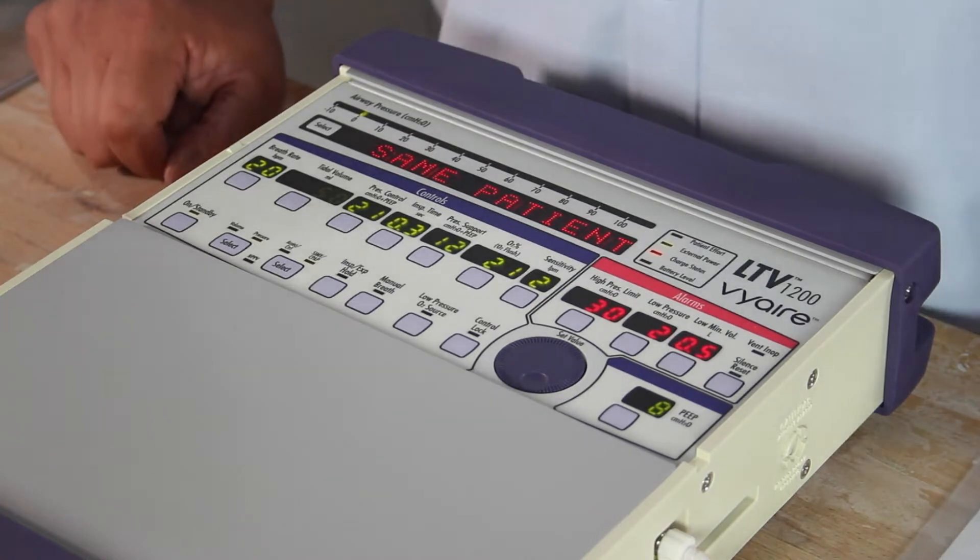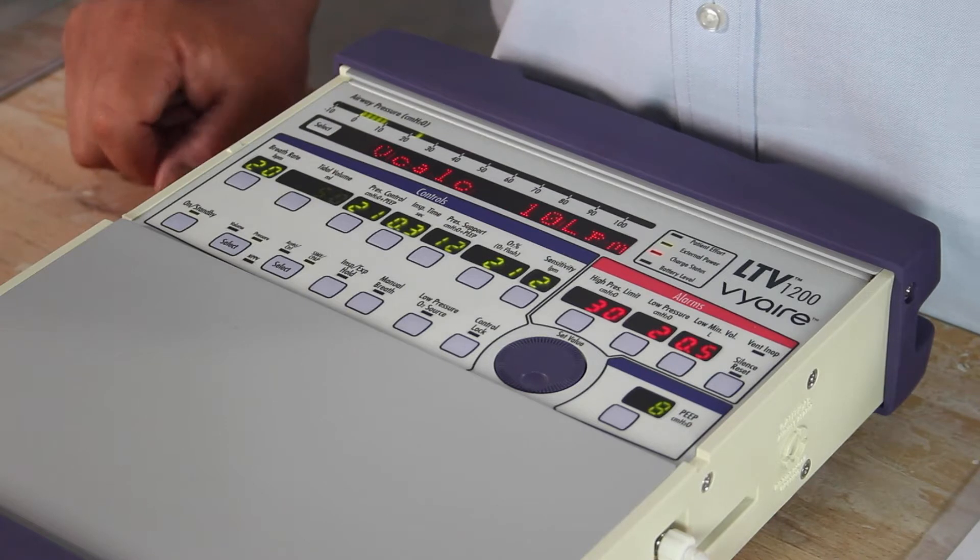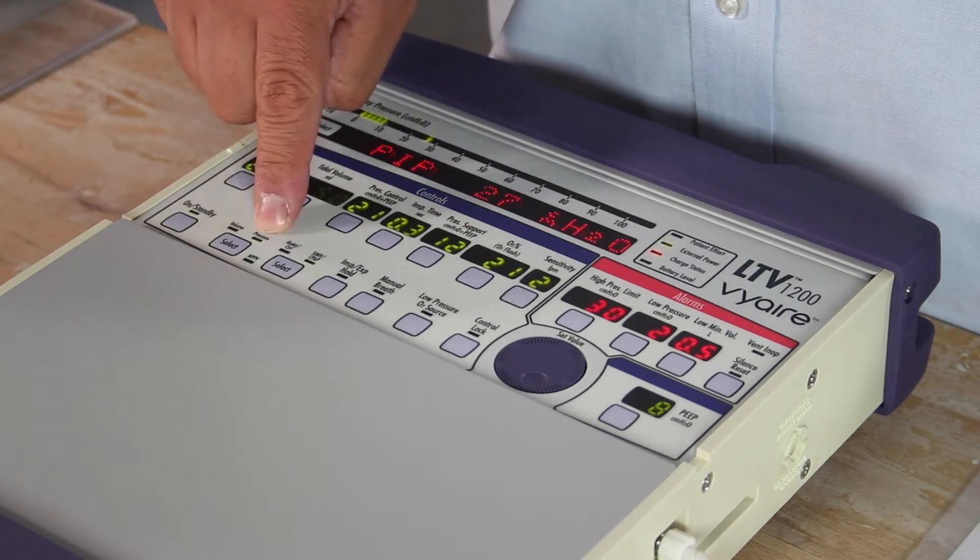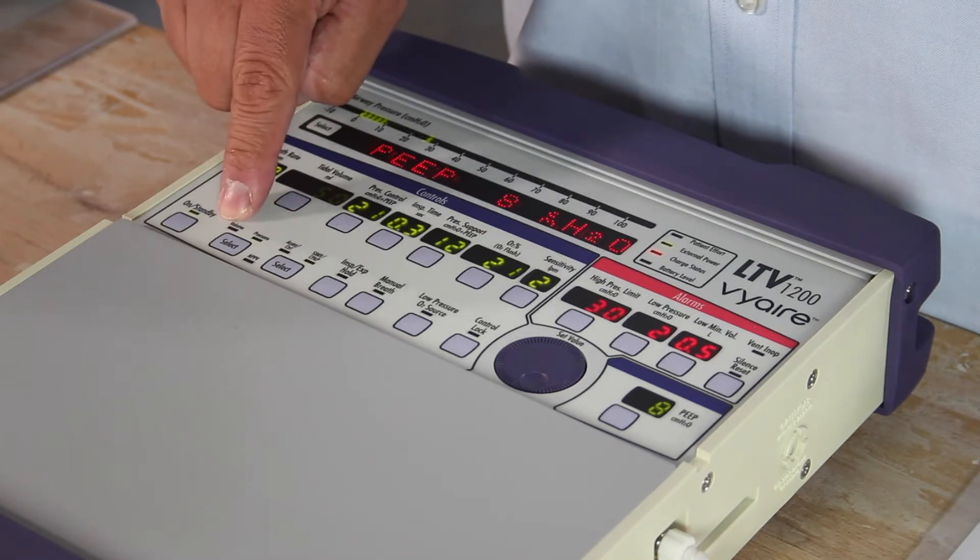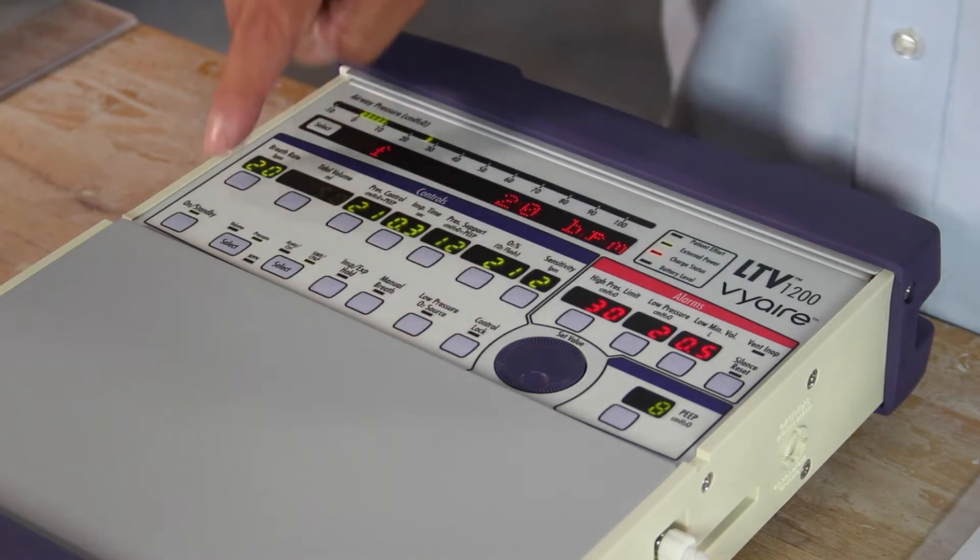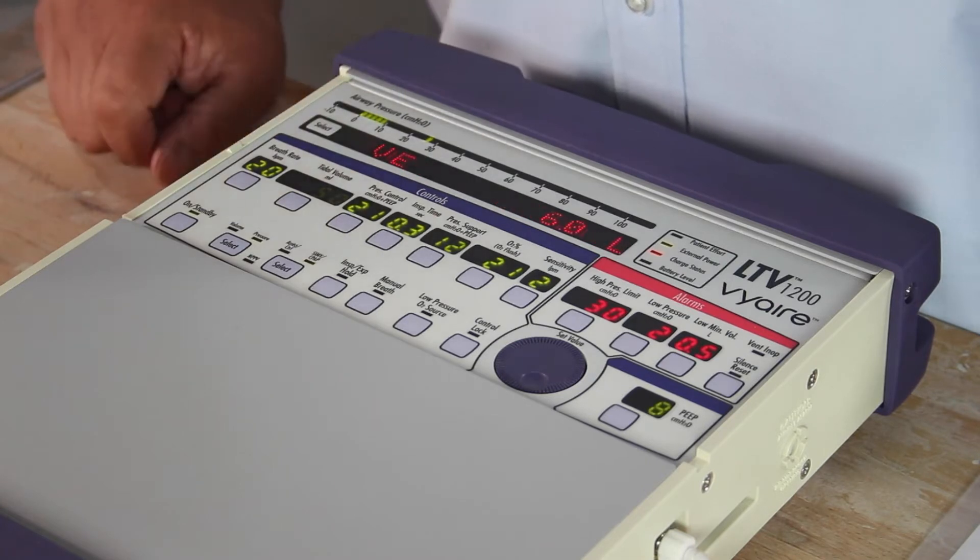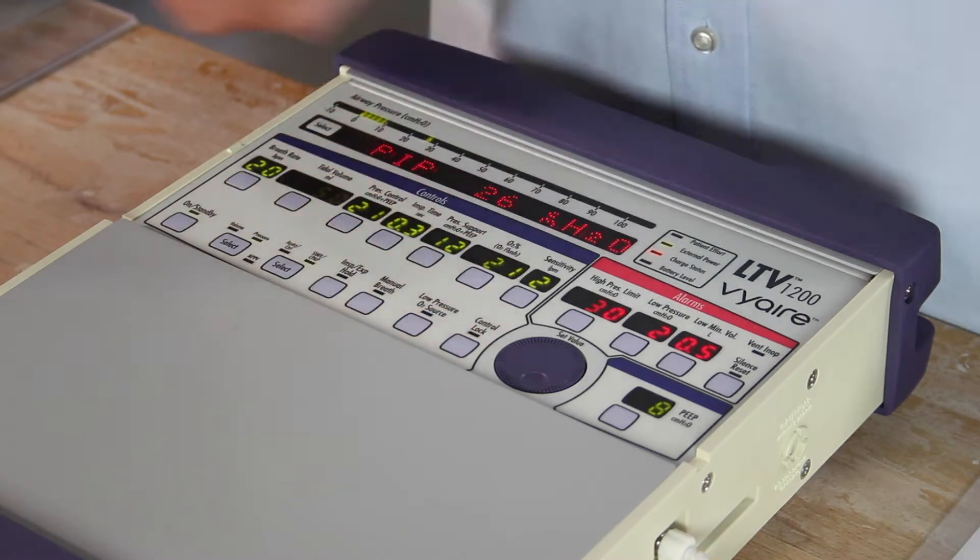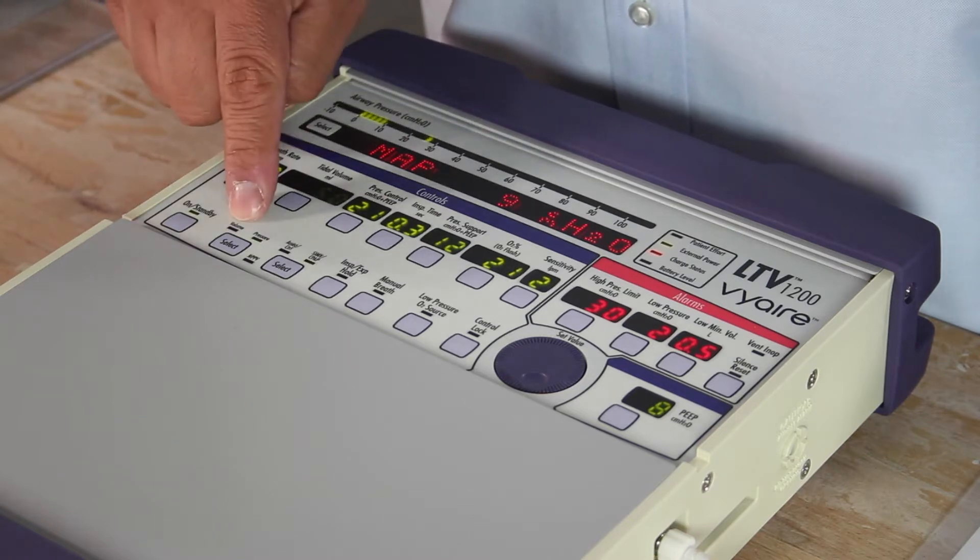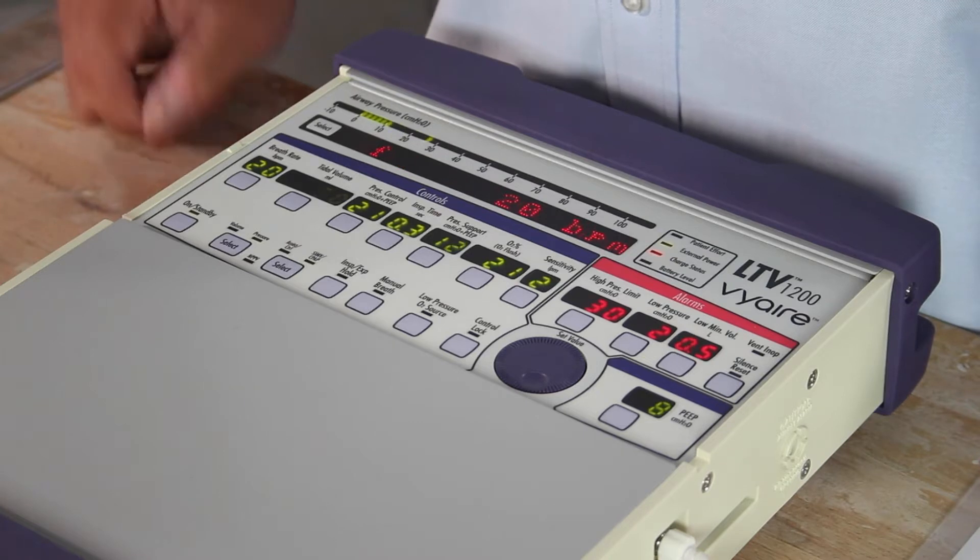The ventilator can be run in volume and pressure mode. Currently we're in pressure. Whichever mode is being highlighted or whatever we're currently using on the ventilator itself is highlighted. Whatever's dimmed or dashes is not being used. So for instance, dimmed means we're not using that currently. Right now volume is not being used, pressure is highlighted. Pressure is currently being used, pressure control of 21.